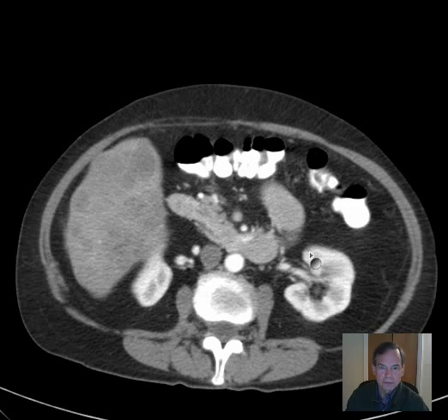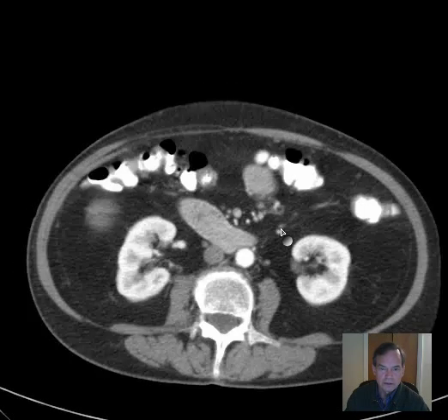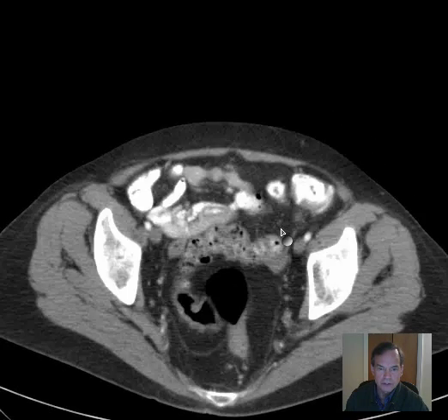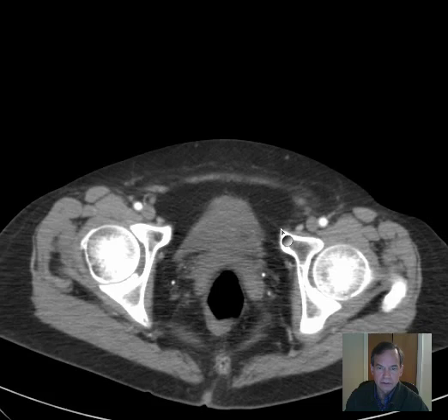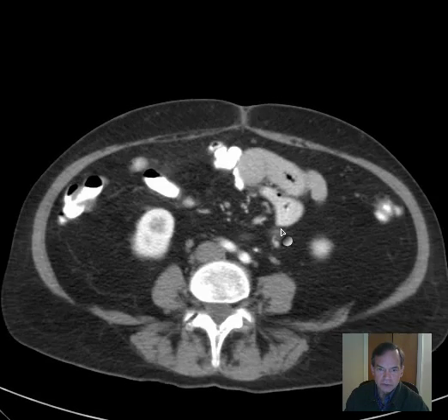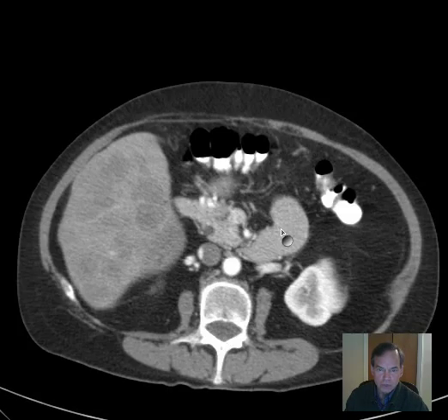Hello there, this is Dr. Mintz. This is a 74-year-old patient with a history of difficulty swallowing.